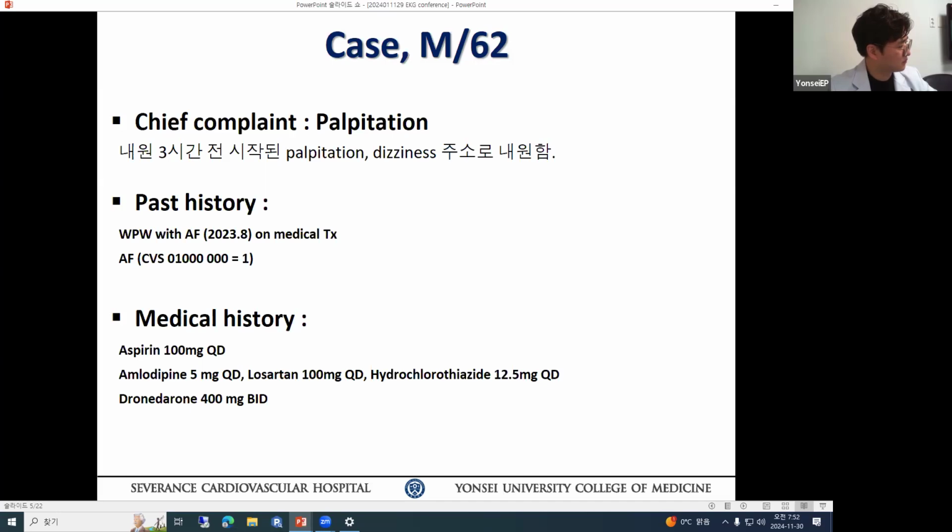First, it's not only atrial fibrillation, it may be iatrogenic. But I explained to the patient that they have some risk for atrial fibrillation. If the patient has no event, then I will wait for 5 minutes and follow the patient just one time.